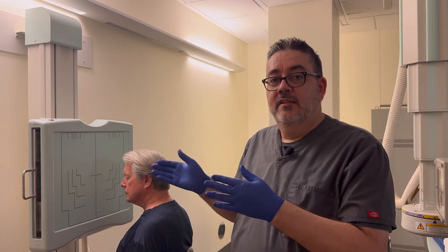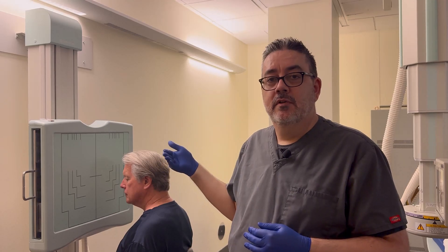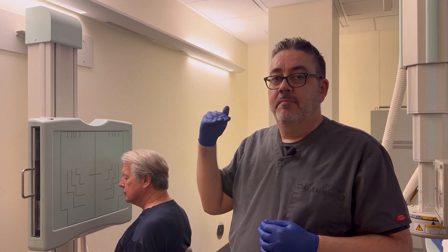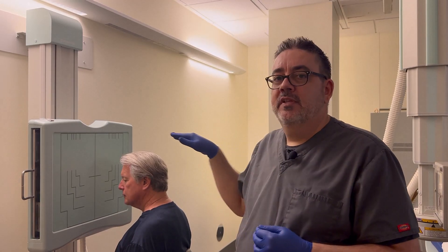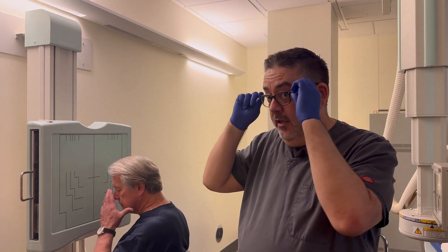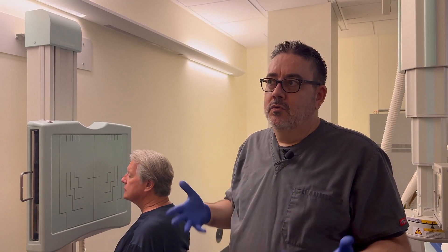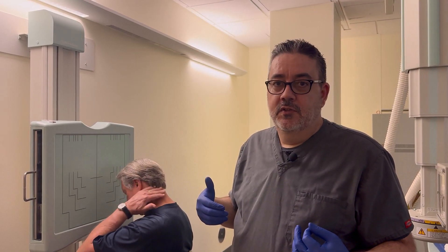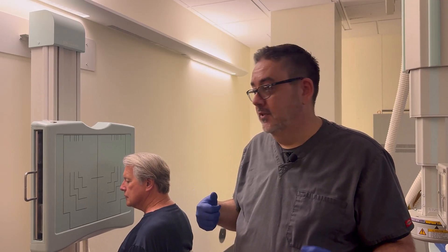We're going to rotate the patient. We'll be doing a right lateral to have the right side against the board. The IOML should be parallel to the floor, and we're going to make the interpupillary line perpendicular to the upright bucky. Things that are going to be a little bit more difficult to spot here are tilt and rotation, so we're going to take some extra time during the initial positioning to try to eliminate those.